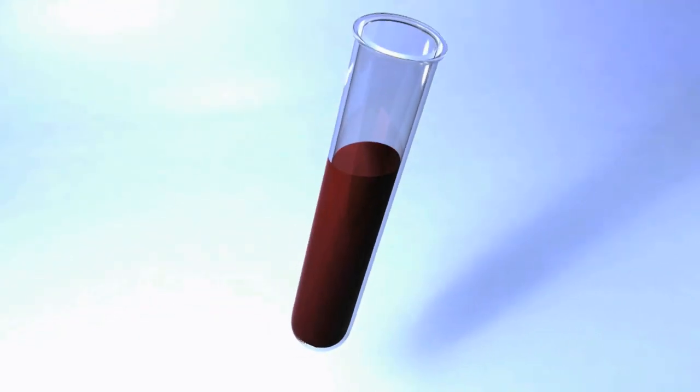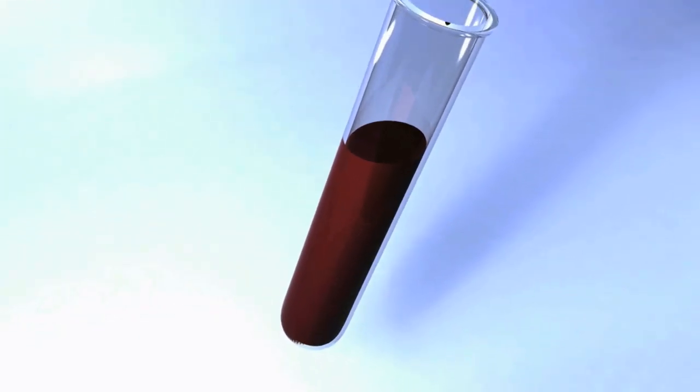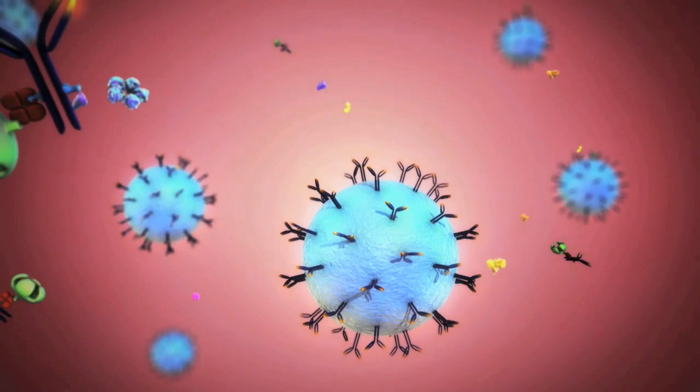The Simoa process begins when standard paramagnetic particles coupled with an antibody designed to bind to a specific protein target are added to the biological sample.